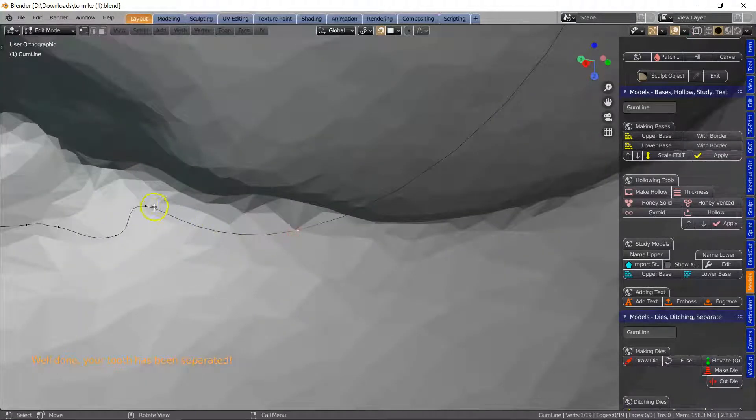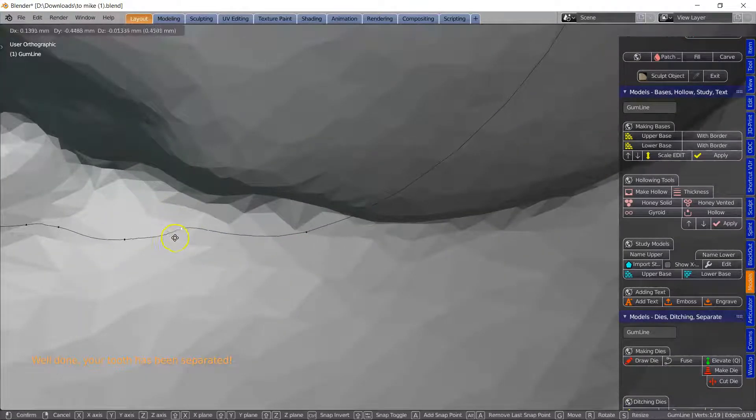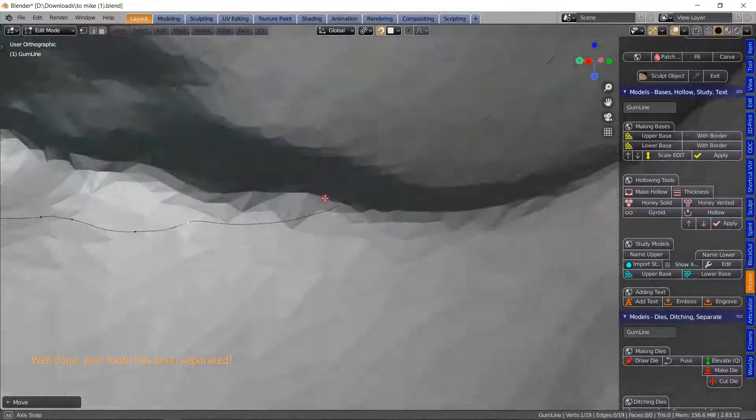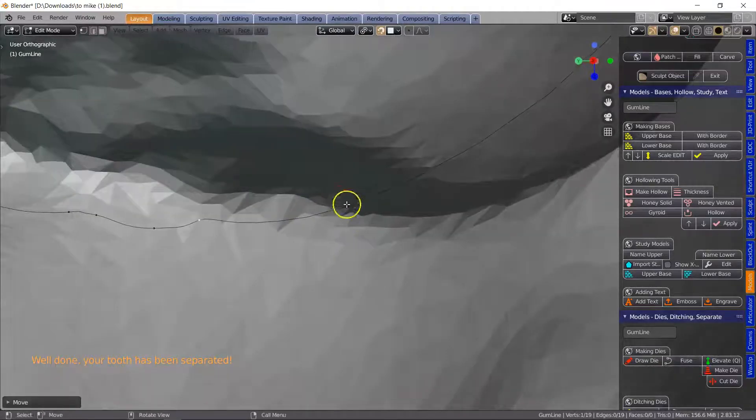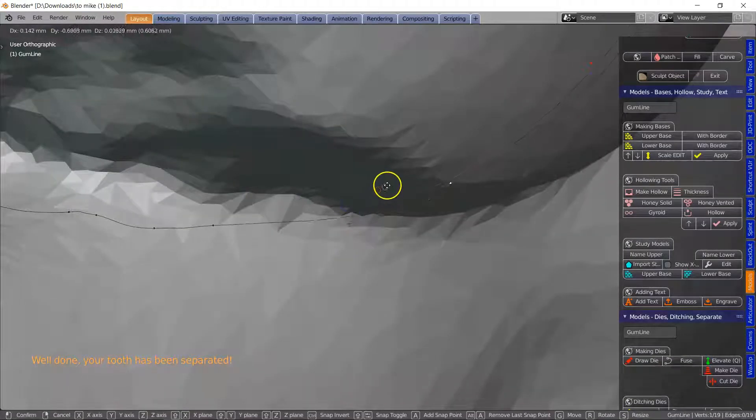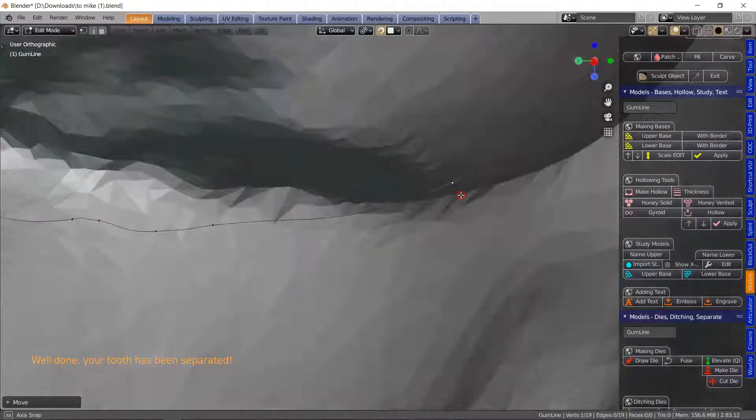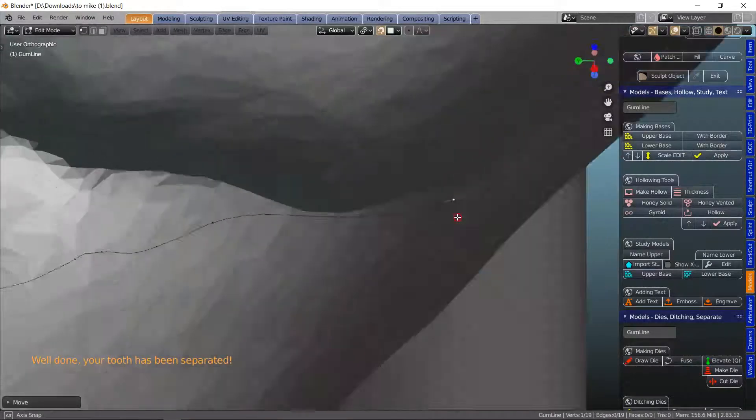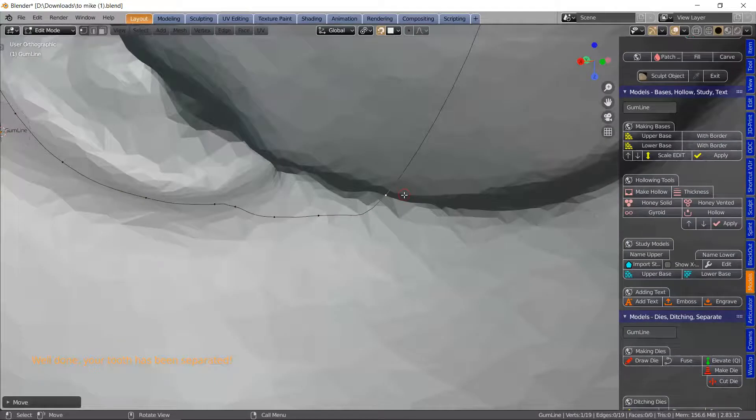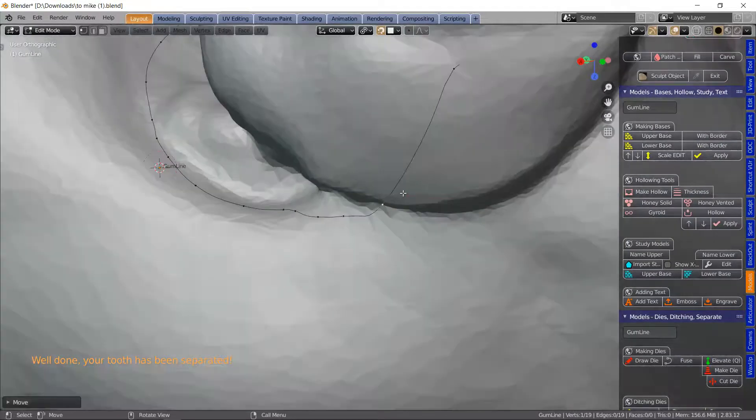So what I'm going to do is just neaten this out a little bit with the G key to make sure that is offset.